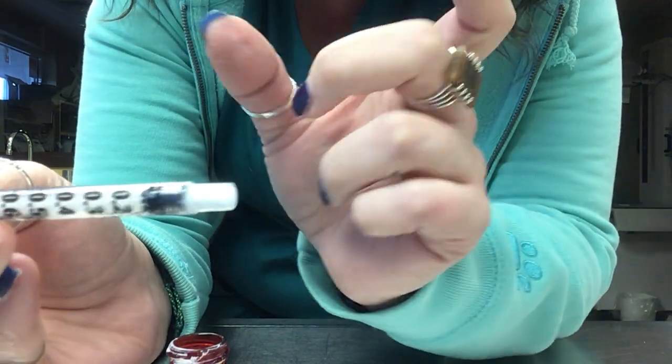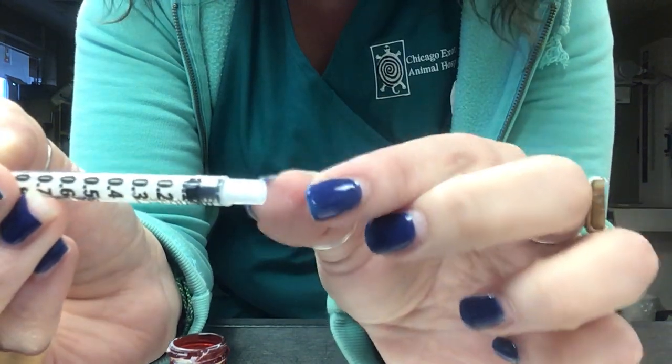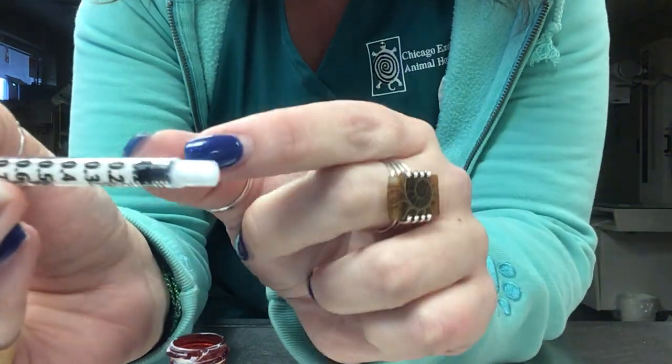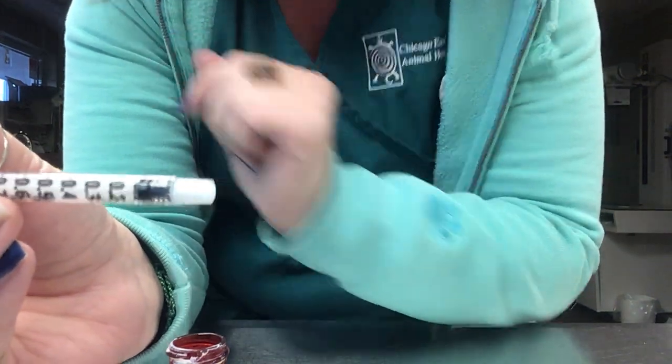The syringe is calibrated to account for that residual in the tip, so don't be concerned about it. You gave the part that is measured, which is the 0.09 right here. Let us know if you have any more questions.